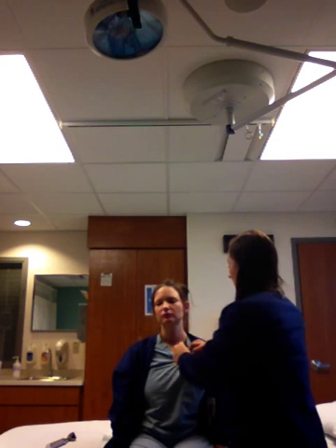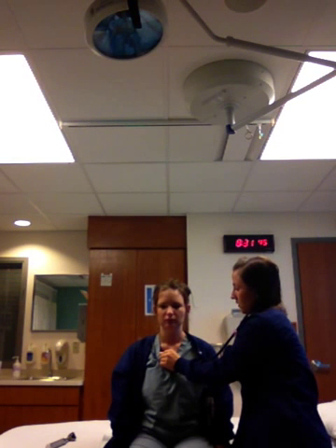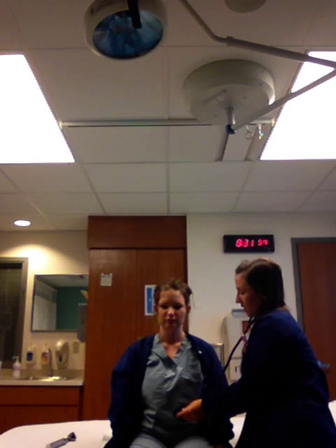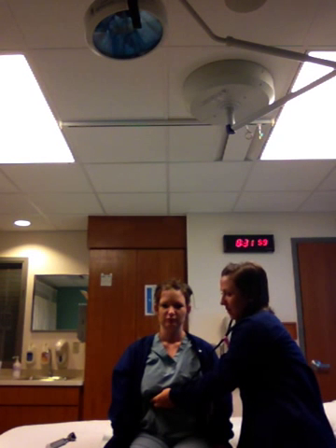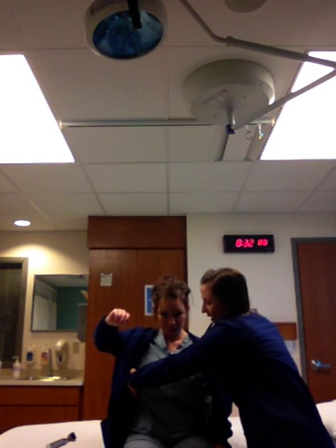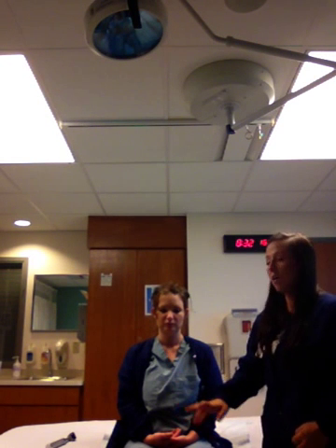So next I'm going to listen to her lung sounds. And I'm going to do this at the second intercostal space. In the fifth intercostal space. Or the third. Now the fifth. Sometimes on female patients you have to lift the breast tissue to get the fifth, and then the mid-clavicular line. Okay, and her breath sounds are clear, and I can auscultate them in all those areas.